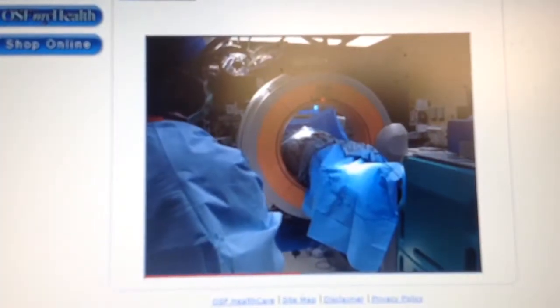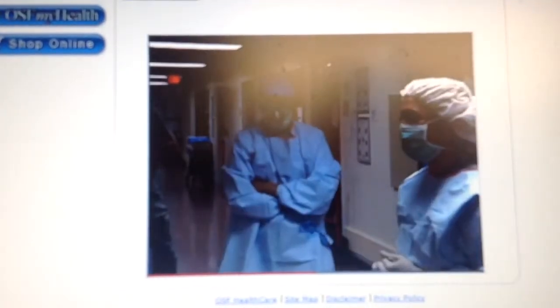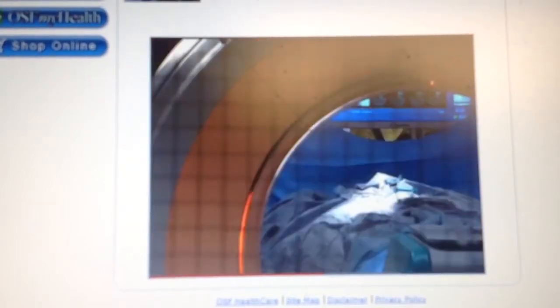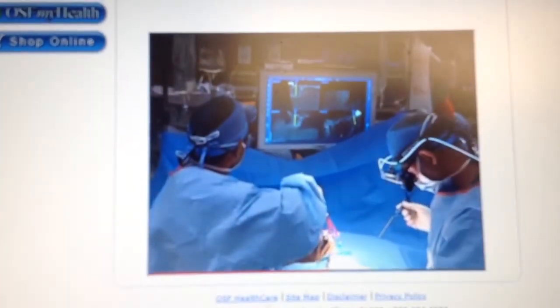Whereas if you have a patient with a deformity where the spine is either twisted or deformed in some fashion, the anatomy is totally obscured, and placing screws into that anatomy is very, very challenging. With this technology, it makes it 1,000 times easier. We're able to see three-dimensionally and know exactly where our screw needs to be placed.